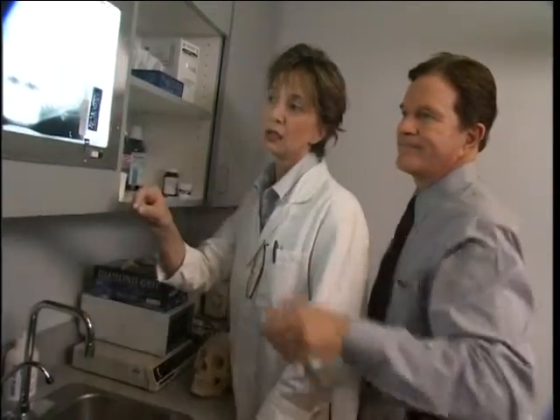Dental implant treatment is a team effort that includes the patient's oral surgeon, and general or restorative dentist. The oral surgeon performs the actual dental implant surgery, but it's the dentist who, for a separate fee, creates the crowns, the bridges, or the denture that will be later placed over the implants. The professional team frequently interacts, reviewing films, determining the number and position of proposed implants, and otherwise working together to plan optimum treatment. The procedure involves two separate surgeries which take place up to 6 months apart.